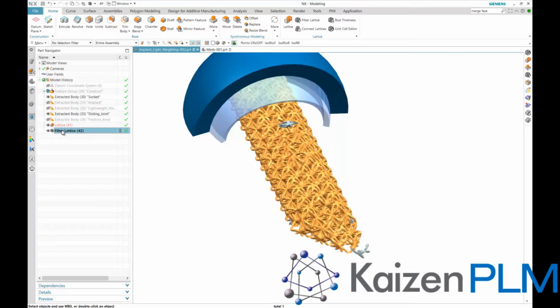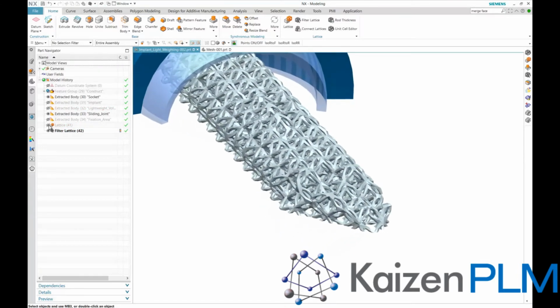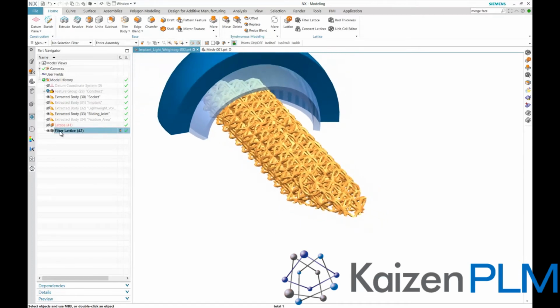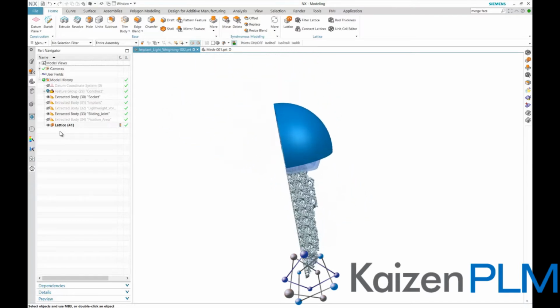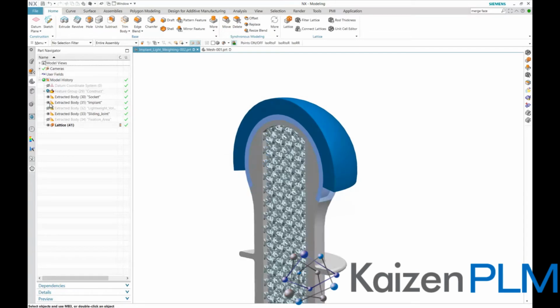We can hide and show the original lattice and the filtered version of the lattice to see if it is what we require. In this case, we undo the result as we want the lattice to actually be part of the implant and therefore be limited by the volume defining it.